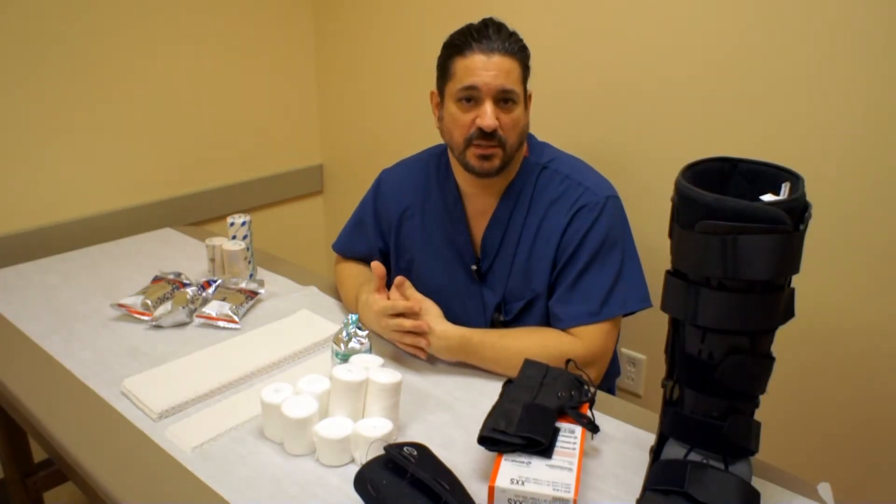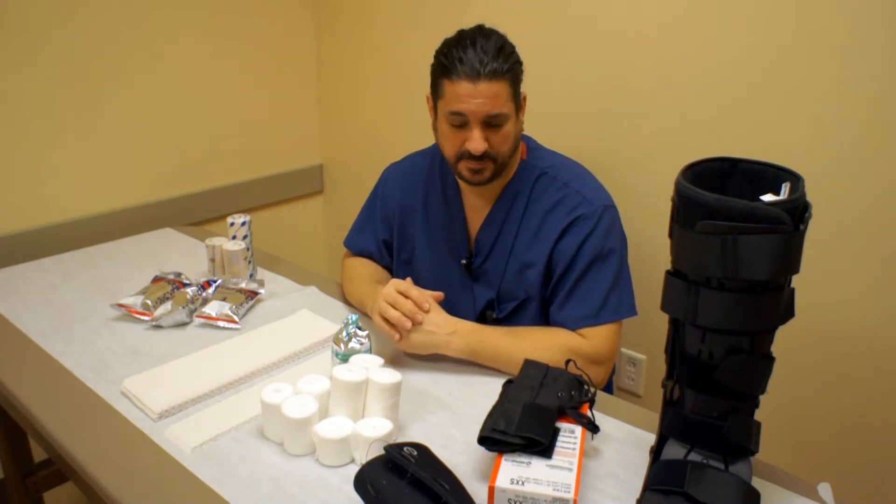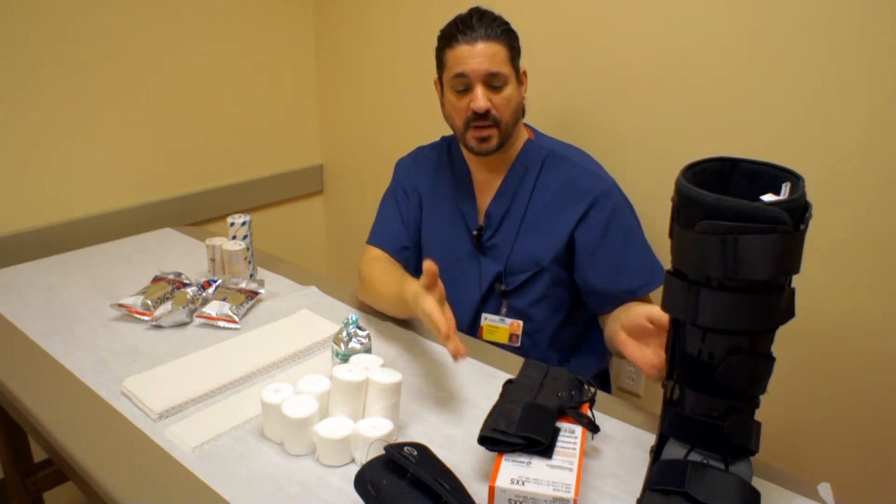The first type of immobilization that I want to show you are the soft goods, the braces. We offer a wide variety of braces. I brought a couple to show you.